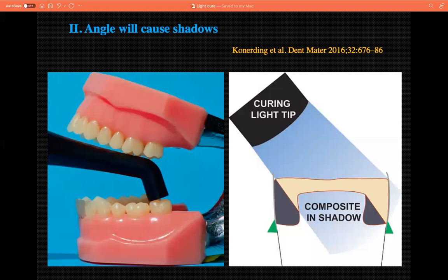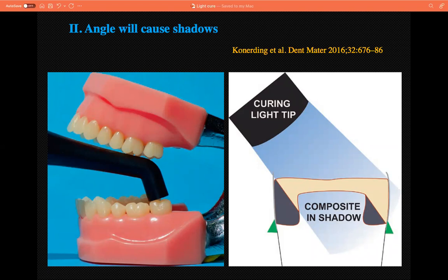The second clinical tip: angle causes shadow. If you don't place the light cure unit parallel to the composite, you can see in the picture there is a lot of shadow in certain areas. These shadowed areas will be unpolymerized — no proper polymerization. If there is no proper polymerization, there is more shrinkage, leading to post-operative sensitivity, micro leakage, discoloration, and all related problems. It is very important to keep the light cure unit very much parallel with the restoration.